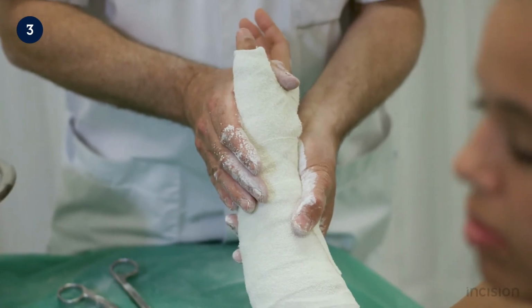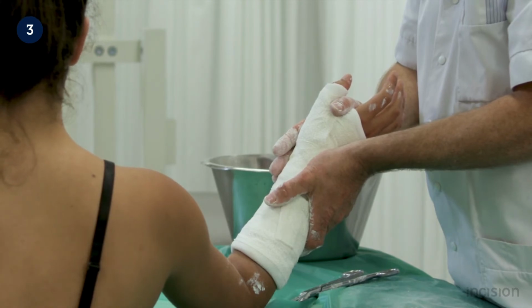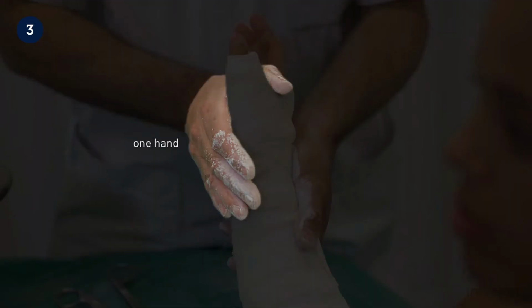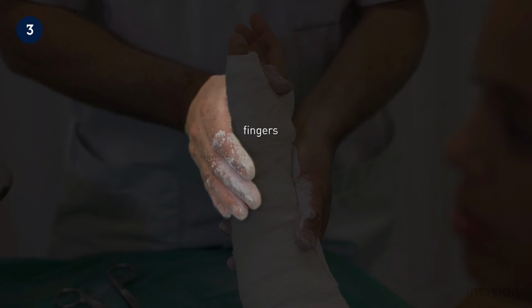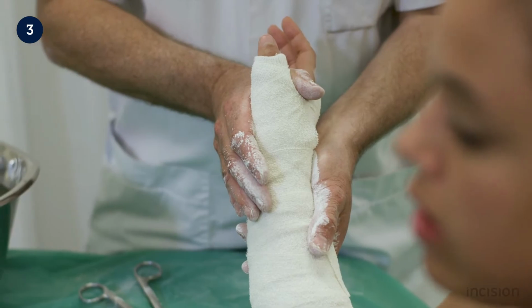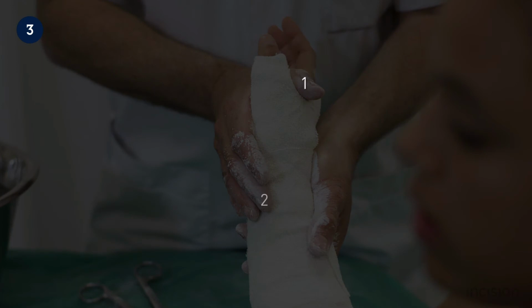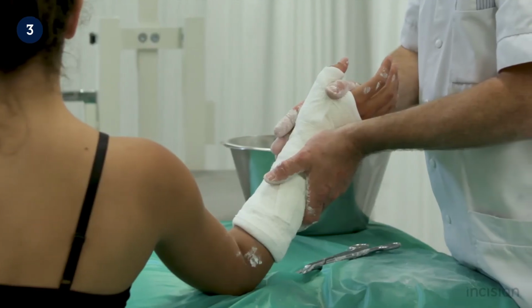The plaster is molded with the wrist joints slightly extended and in ulnar deviation. Care should be taken to avoid molding the plaster using fingertips, as pressure points may arise. One hand is placed in the first web space, with the thumb on the dorsal side, and the rest of the fingers on the volar side. This way the fracture is supported because it is located between the fingers of the orthopedic cast technician. The other hand is placed more proximally. This creates a 1, 2, 3-point fixation, which is needed to adequately support the fracture. The plaster is supported in this position until it is hard enough.